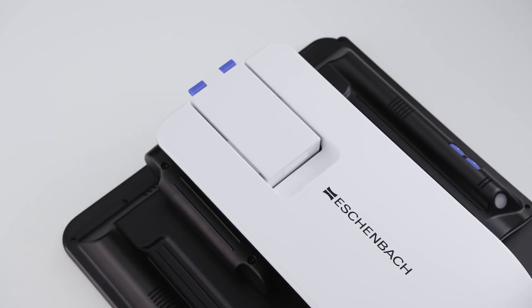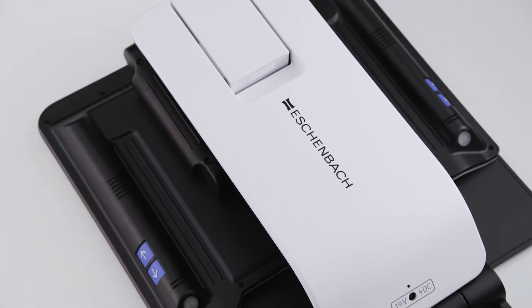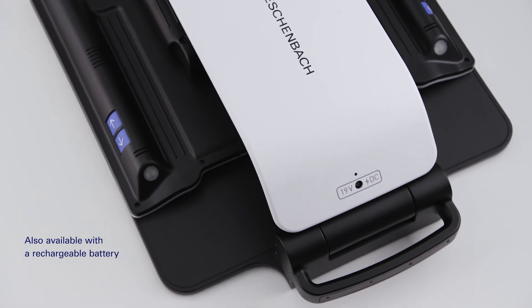The Vario Digital FHD Advanced is also available with an optional rechargeable battery so that it can also be used without being connected to an electrical outlet.